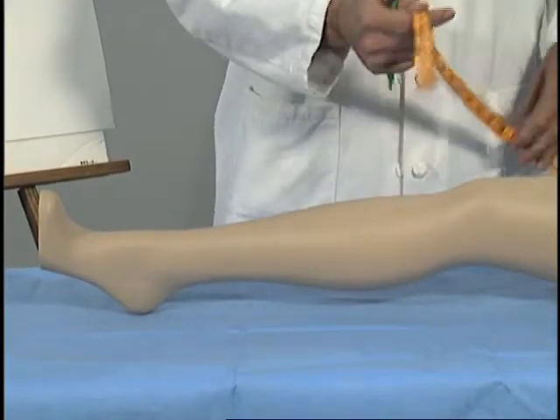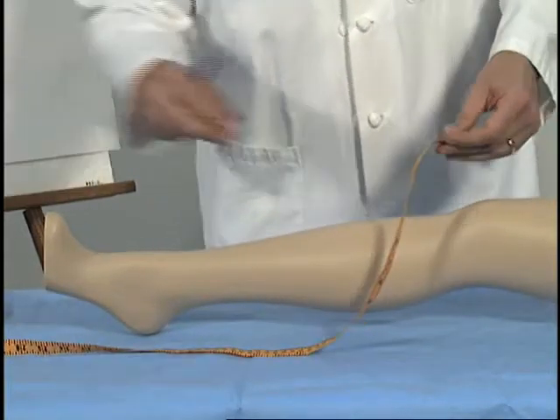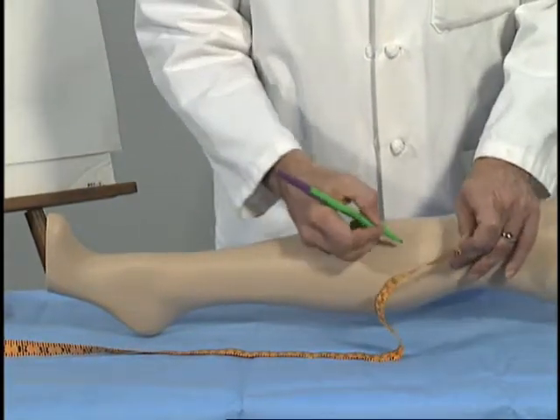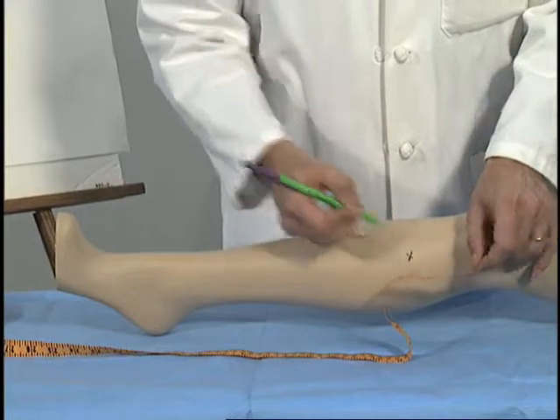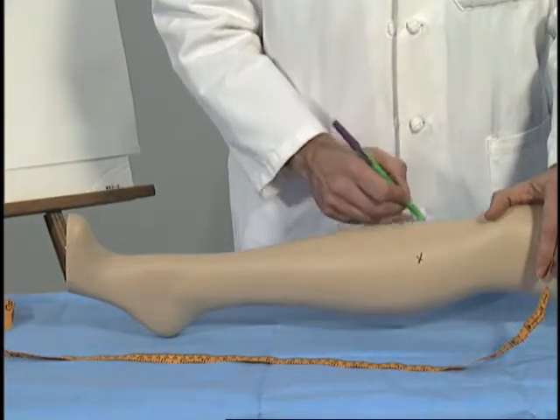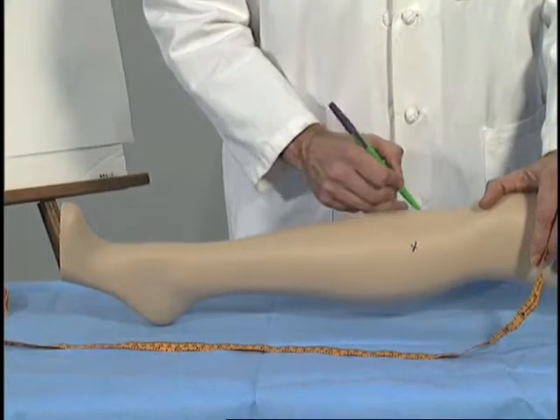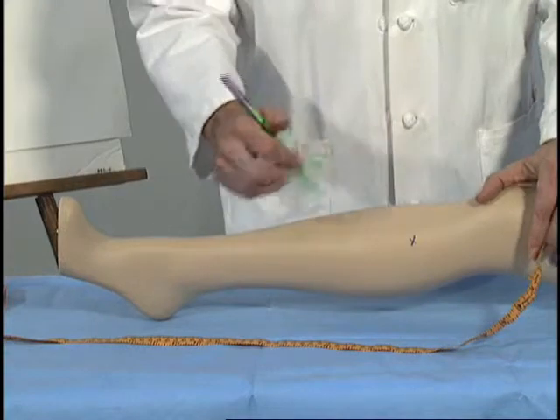This also can be generally seen pretty well with your ultrasound by visualizing the anterior tibial vein. Marking the spot where this exits the fascia is generally at about the level of the termination of the tibial-peroneal trunk, and it is in this case as well.